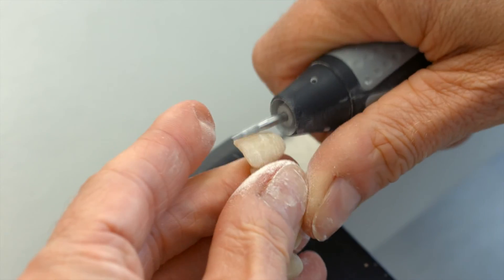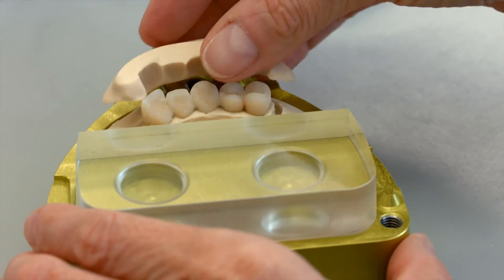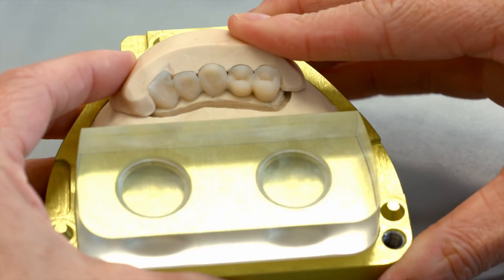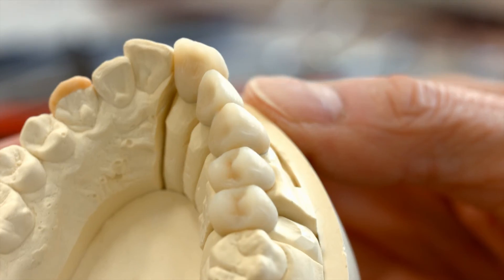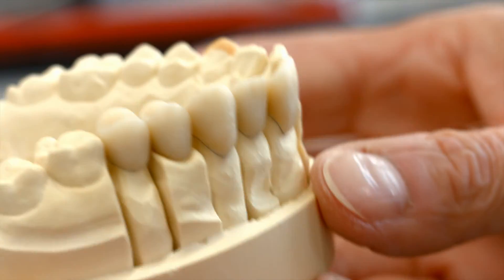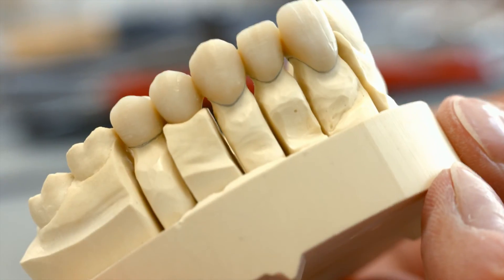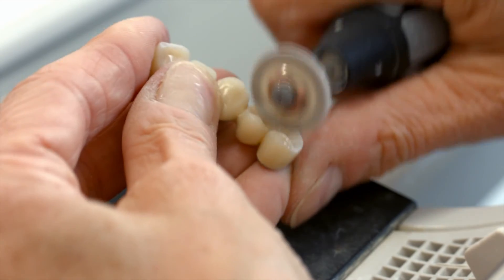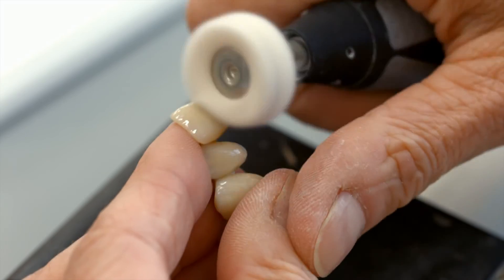Finish the pressed parts with tungsten carbide burrs or separating discs. Remove the press flash and contour the restoration to the desired shape. Place the bridge on the model to check the contacts and the occlusion and make any adjustments. Finally, polish the restoration with goat's hair brushes, cotton buffing wheels, and suitable polishing agents.